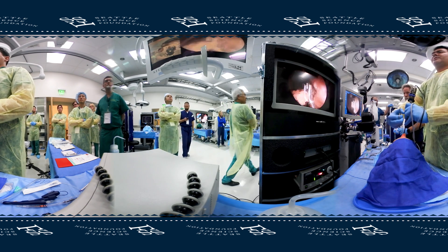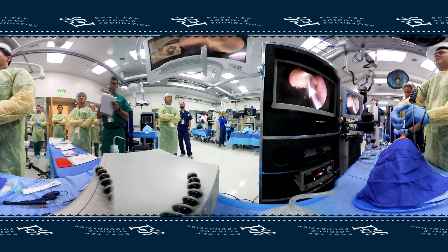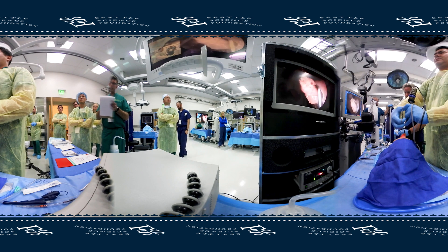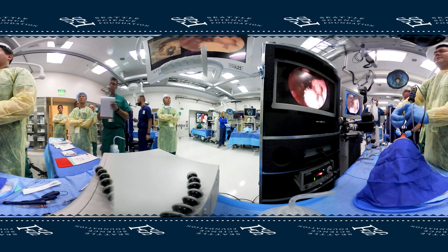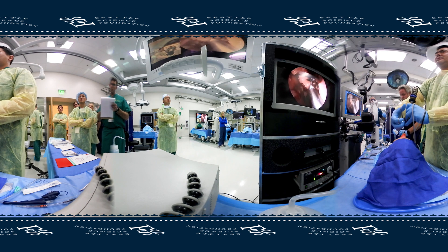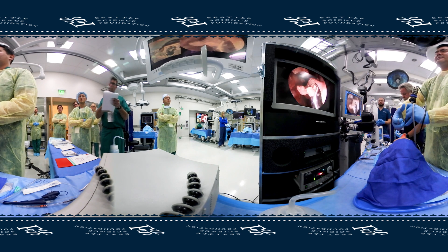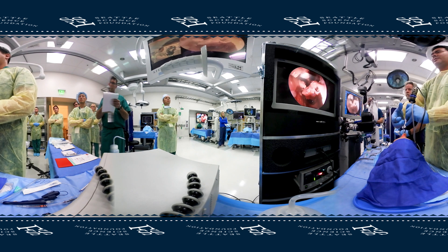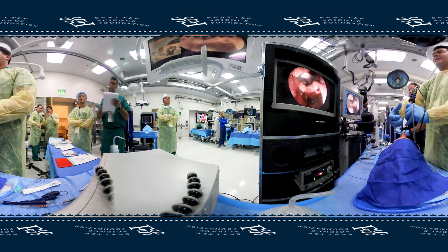Some people will start with the anterostomy and just come down through the turbinate — you can go either way. Also realize that as you're resecting the inferior turbinate, there is going to be a branch from the sphenopalatine artery that comes in at the posterior end. So when you do resect this, you have to make sure that you deal with that stump. I'll cauterize the stump every time, whether it's bleeding or not.